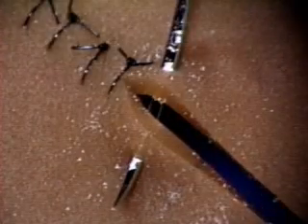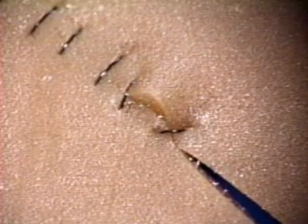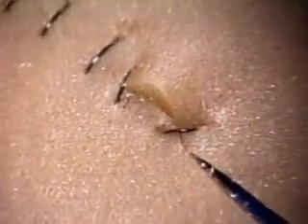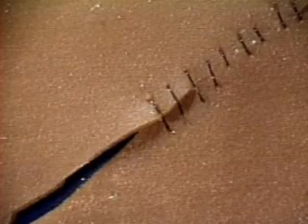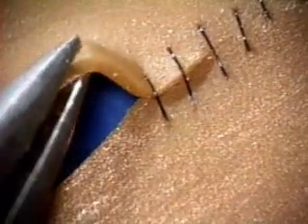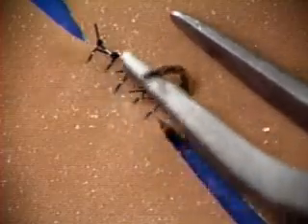Here's another bad stitch. The needle has crossed the wound obliquely instead of at 90 degrees. When that's tied, the long edge will pucker, see right here? And again, you'll have exposed tissue. Here's a third bad stitch. The 2 bites are just too big. If you do a series of those, you'll get complete overlapping of the edges. Remember I said don't let go of the needle between going in and coming out? If you do, your efforts to regain control of the needle will likely lead you into a struggle like this.